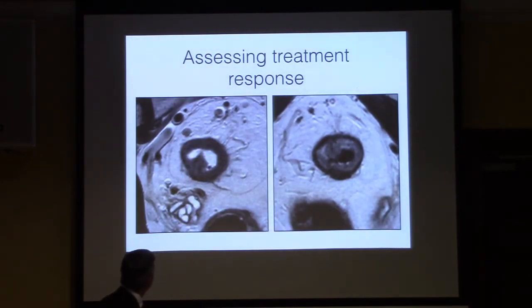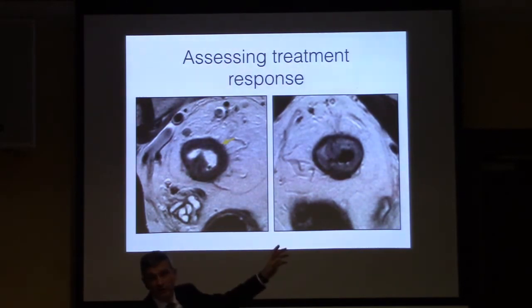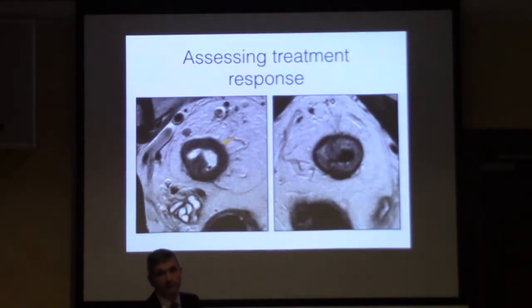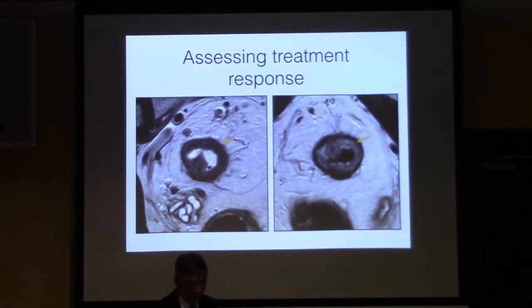This one here is another patient who had circumferential tumour beforehand, and as you can see, the pre-treatment there was tumour spiculation, which was desmoplasia. I've now chosen the wrong image, because actually the follow-up image, which looked like that, the desmoplasia looks the same, whereas the primary tumour had responded. So that's how I knew confidently it was desmoplasia, peritumoral fibrosis. Unfortunately, I've chosen the wrong picture, just to show. But what I have shown you is that now we've got relatively normal looking submucosa and mucosa. I can't confidently identify the tumour there.